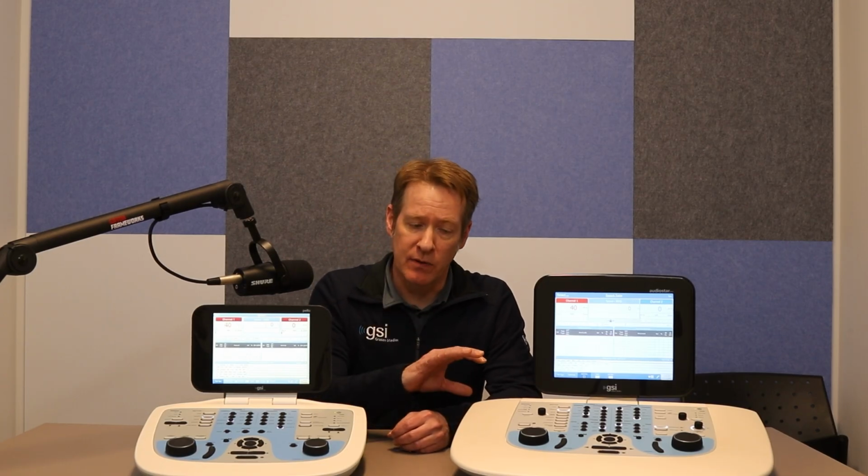So the first thing that we'll want to do is navigate to the speech screen, and then we can go ahead and hit the word nav icon. And what that will do is bring up a variety of different options that you can go through. Now, if we go all the way over to the right side, we can see that we have defaulted the autoplay option as wait for score.